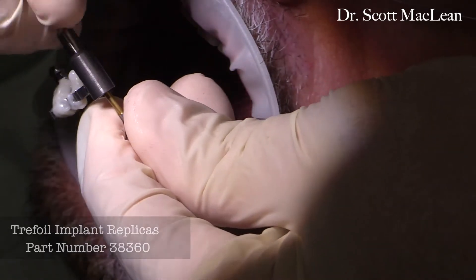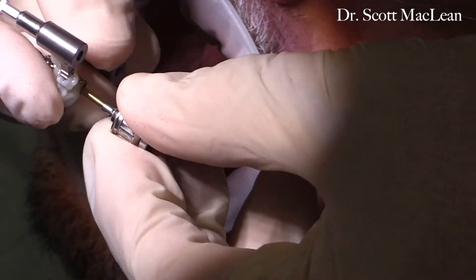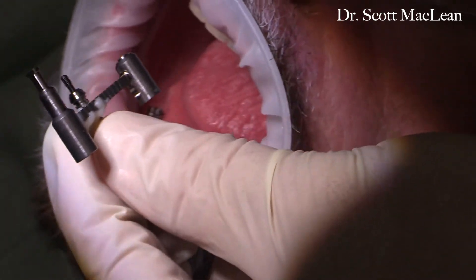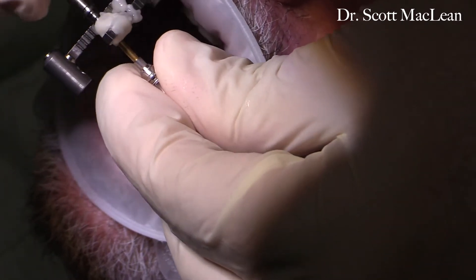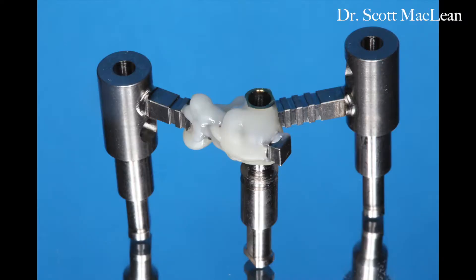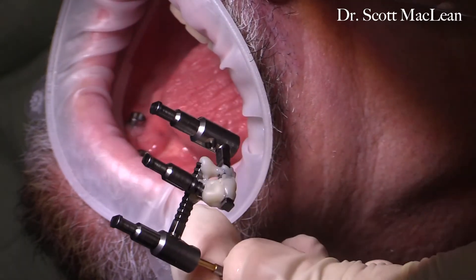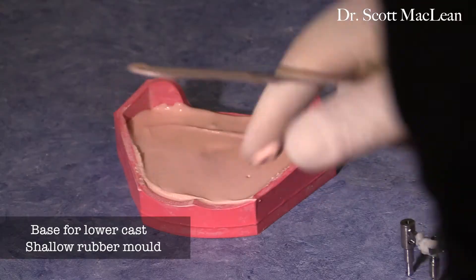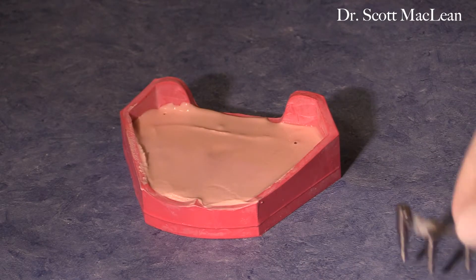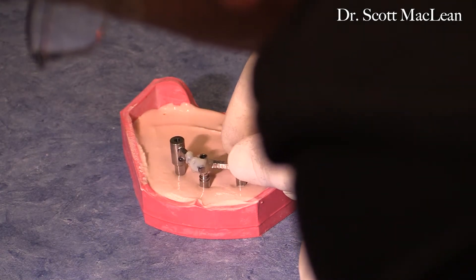Now we're going to take a Trefoil implant replica and attach it. Using the driver and engaging it into the screw, you can twist on the replica — since it's non-engaging — and just hold the driver. This is a good way to put the whole assembly together for transferring your implants into the MasterCast. We're going to pour a base in a shallow rubber base, put some gypsum inside to pour a cast, and then locate this transfer jig assembly in the anterior portion of the gypsum.